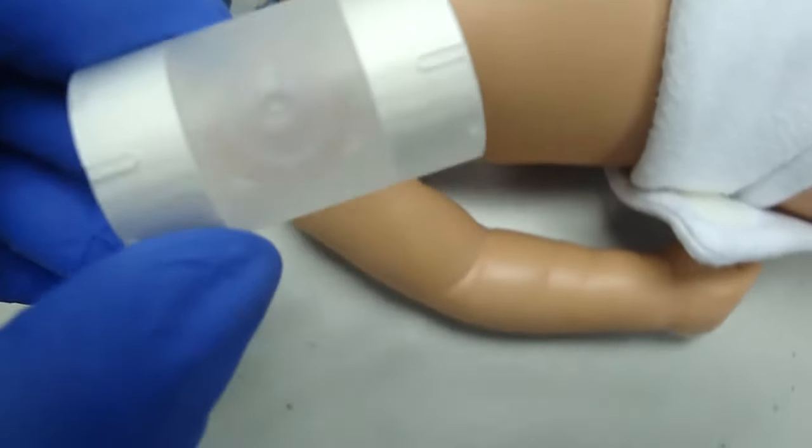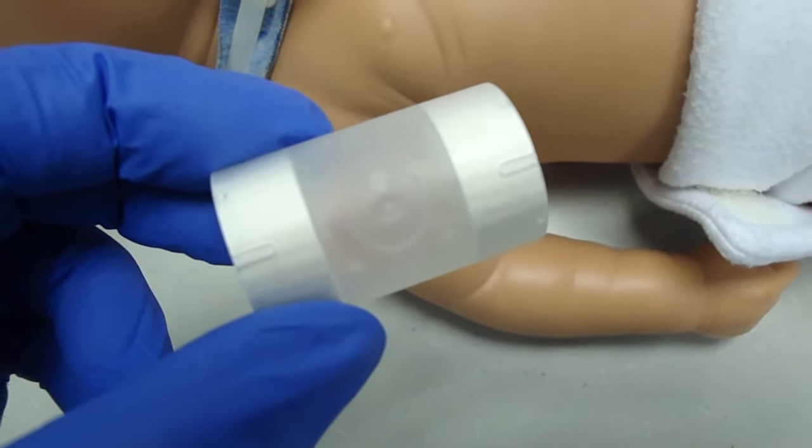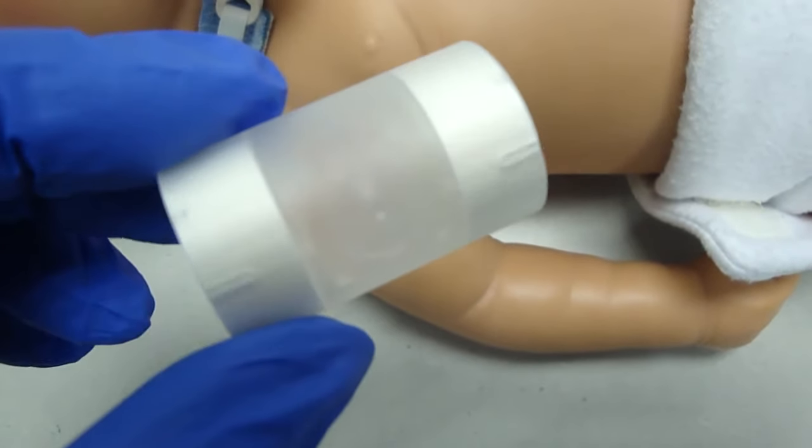The other kind of HME is just the filter. It doesn't have a port. If you need access to the airway, you would have to remove this. And there is no way to give supplemental oxygen with this device.